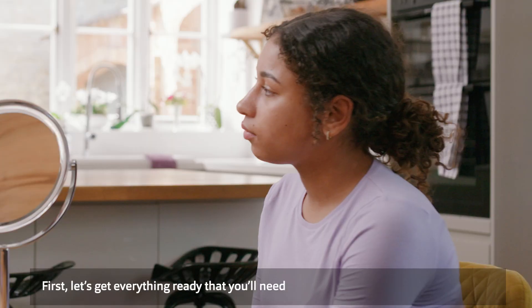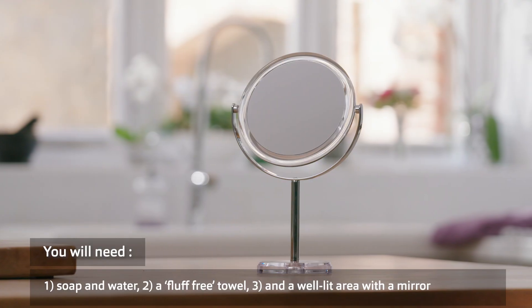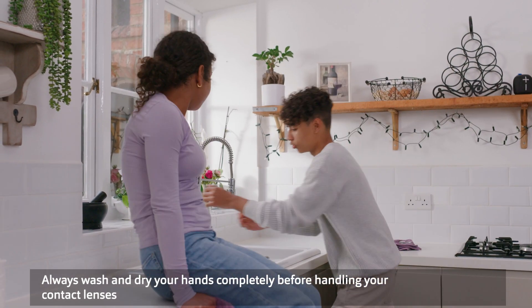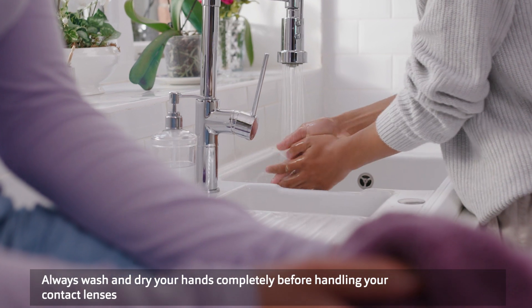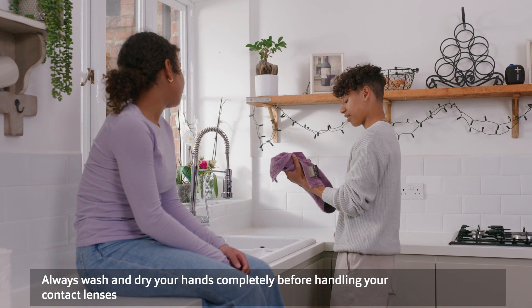First, get everything ready that you'll need: soap and water, a fluff-free towel, and a well-lit area with a mirror. Before you touch your eyes or contact lenses, wash your hands with soap and rinse them well. Dry your hands completely and make sure you don't have any fluff left on them from the towel.